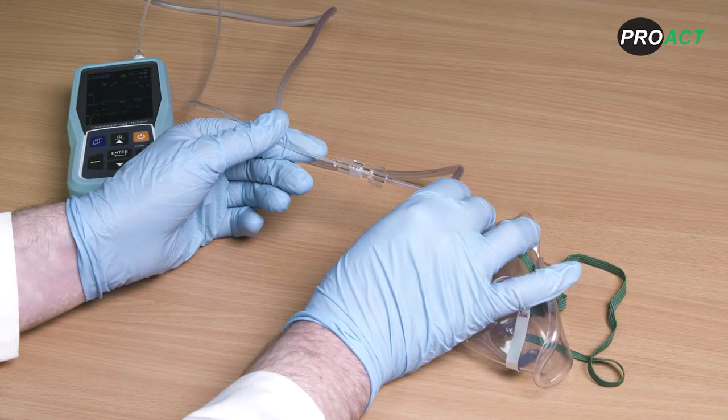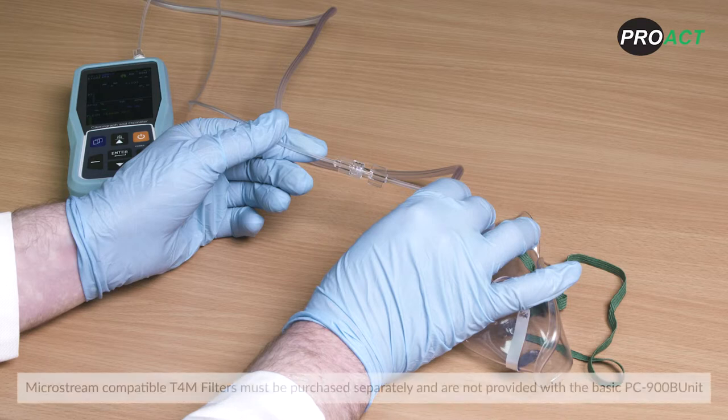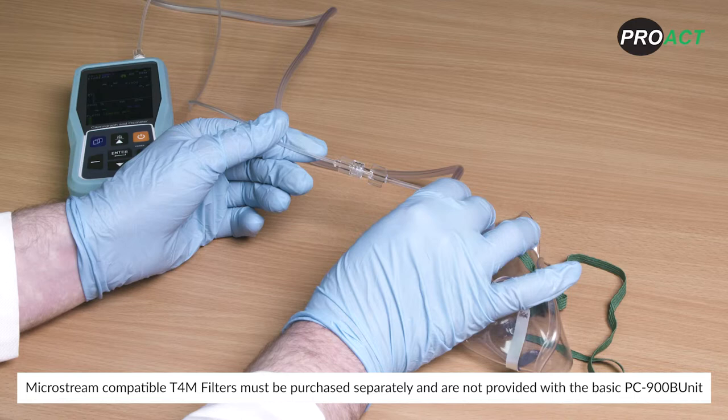A key advantage of the PC900B is that it is a sidestream capnograph, meaning it can work with both intubated and non-intubated patients. Microstream compatible T4M filters must be purchased separately and are not provided with the basic PC900B unit.